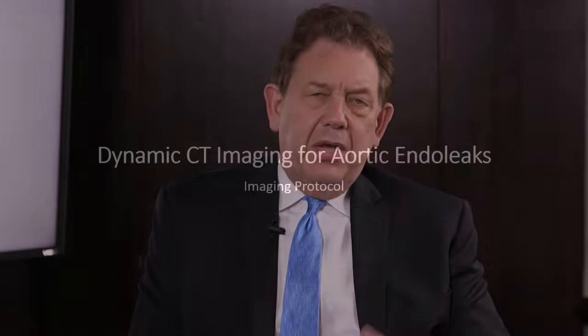So a little bit briefly about endoleak classifications. For most of you, you're probably already aware of this. There are lots of ways pressure can get inside an aneurysm sac, and we're going to focus tonight really on abdominal aortic aneurysms. Again, subsequently we may talk about thoracic. A type 1 endoleak is obviously where flow occurs directly into the aneurysm sac, either around the proximal or the distal attachment site.